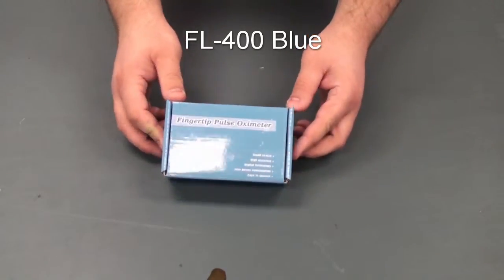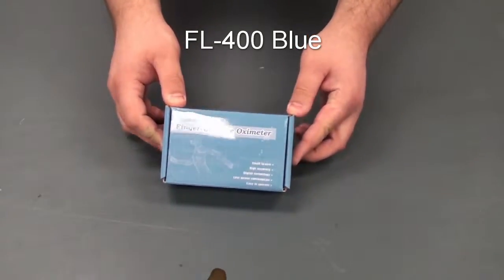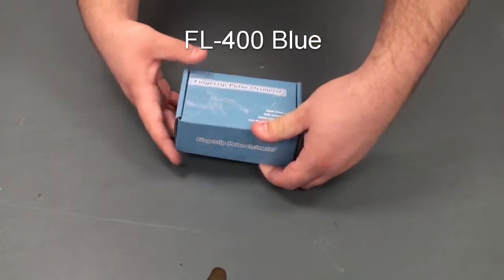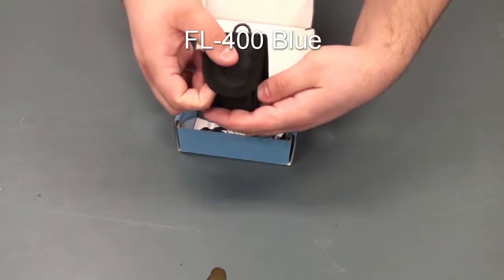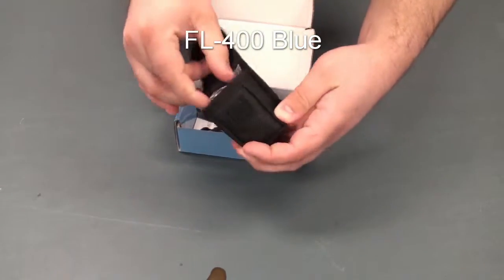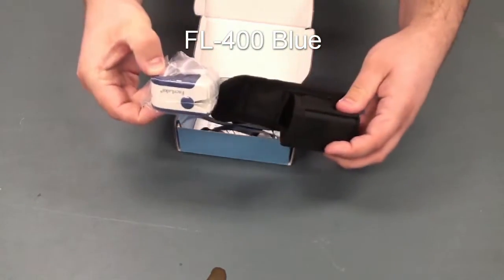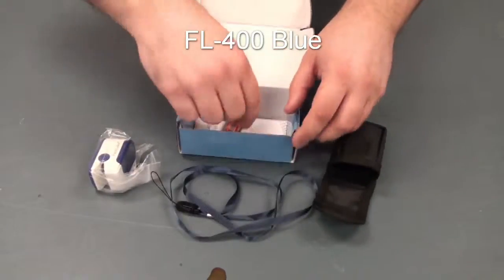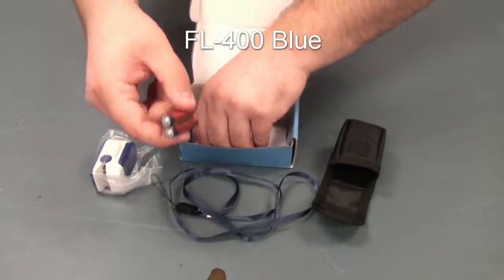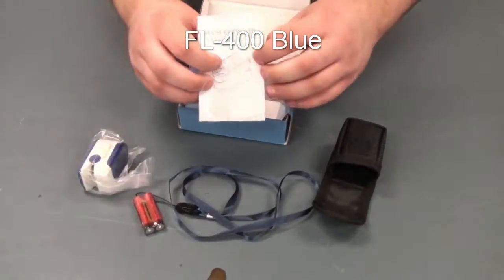Hello and welcome to the unboxing of the FL400 blue color. In each box, you will see a carrying case for the device, along with the device, a lanyard, a set of batteries, and an instruction manual.